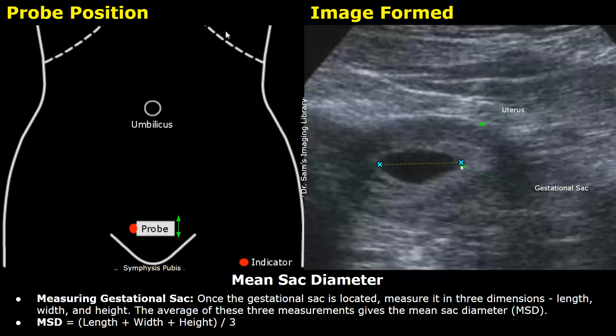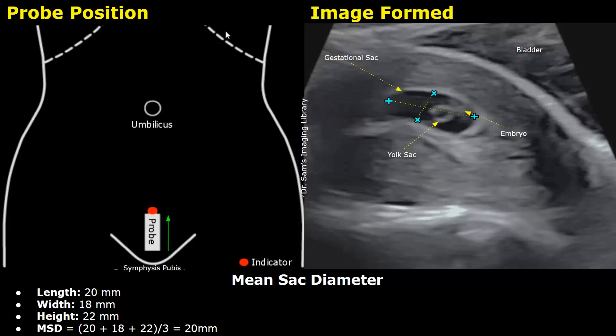The mean sac diameter, or MSD, is calculated by adding the length, width, and height and dividing the result by 3. In this example, the length is 20 mm, the width is 18 mm, and the height is 22 mm. Adding these three values and dividing by 3 gives us 20 mm — so the MSD here is 20 millimeters.